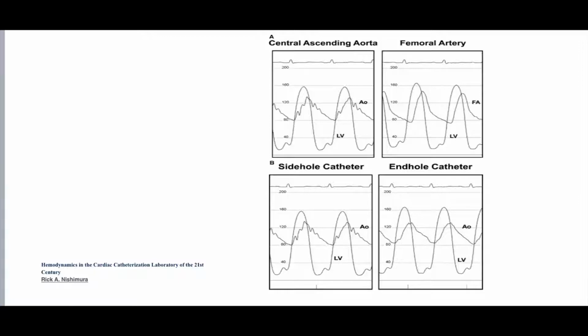So if I want to calculate the aortic valve gradient, I'm searching for how much aortic stenosis I have. I can use central catheter or femoral catheter. But the femoral catheter is going to underestimate or overestimate the gradient? Underestimate the gradient. Very good. And that is why? Because of the distance of the blood going out.